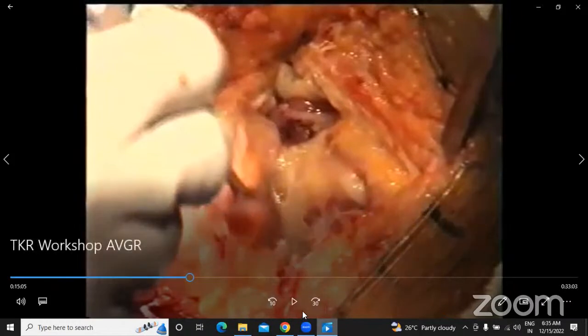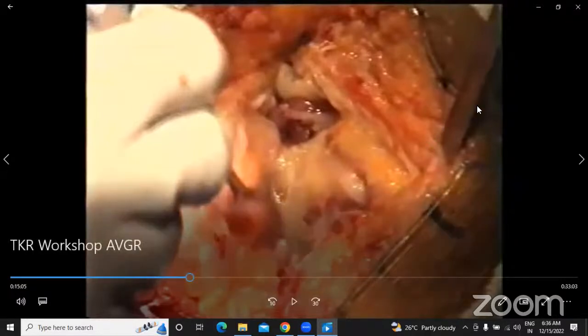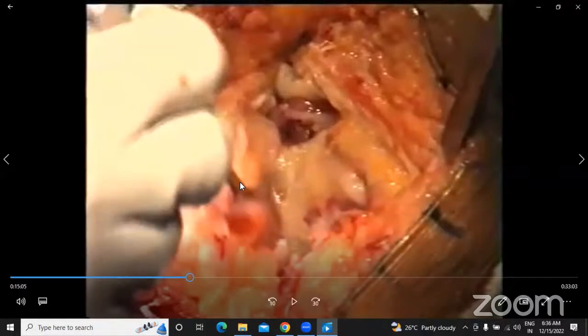Especially in a lot of these knees, there's a lot of tibial rotation and the tuberosity is more lateral than you think. So sometimes when you come down, you would directly go onto the tuberosity and you don't have any cuff of tissue left. Very common mistake. So ensure that you have some amount of tissue towards the tuberosity side so that it helps when you suture.